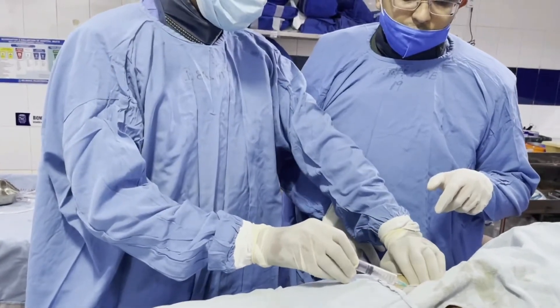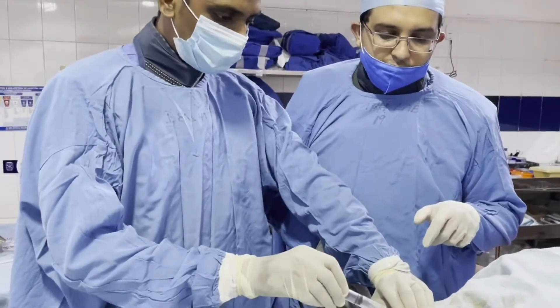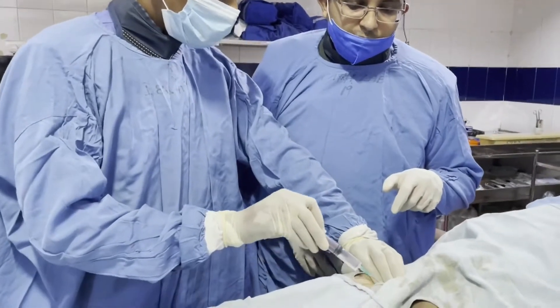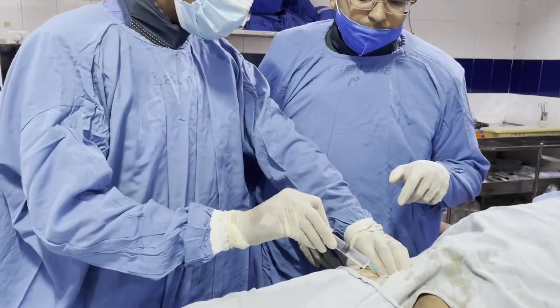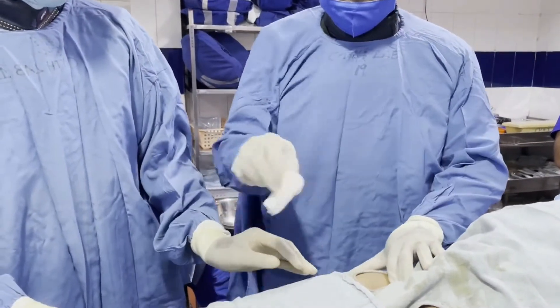To correctly localize into the femoral artery, we need to palpate the artery after getting the rough position, which is 3 cm below the mid portion of the inguinal ligament.